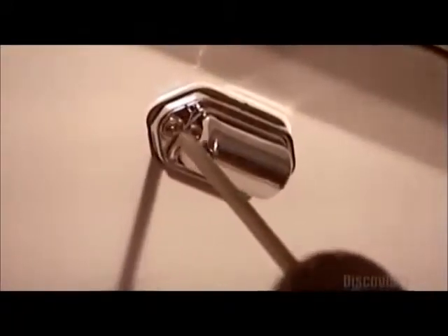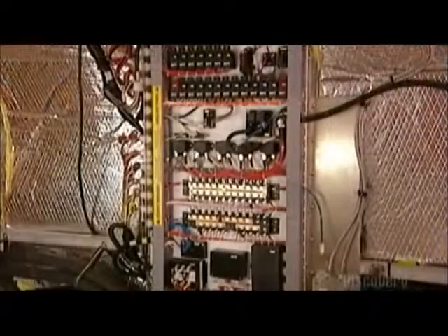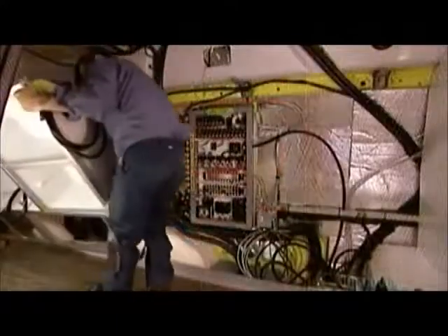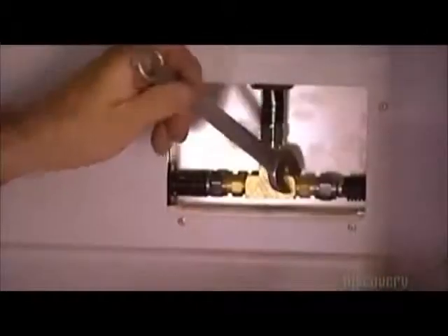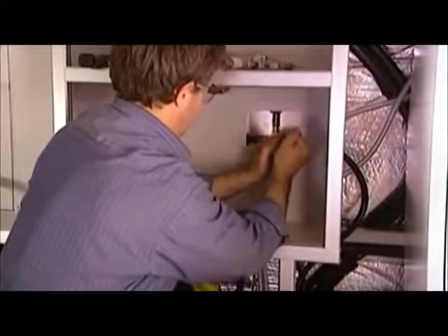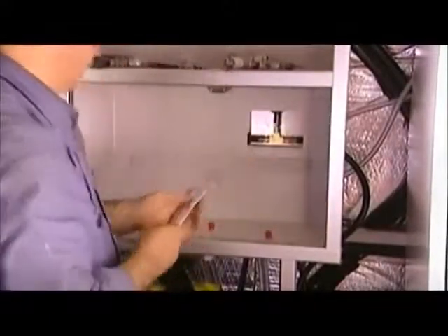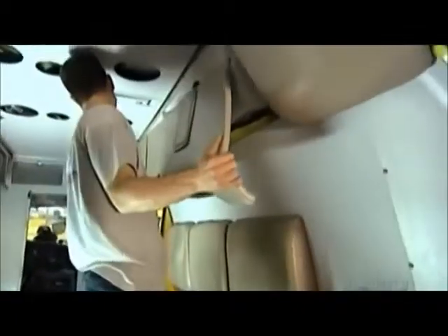After installing the suction and oxygen systems, electricians run the wires for the cabinet lighting. Once the main electrical panel is in place, they can mount the cabinet and hook up the oxygen equipment, the suction machine, and the lighting. A divider between the cab and the back gives the patient privacy. Vinyl-covered foam padding on the ceiling protects ambulance workers' heads when the vehicle jerks.